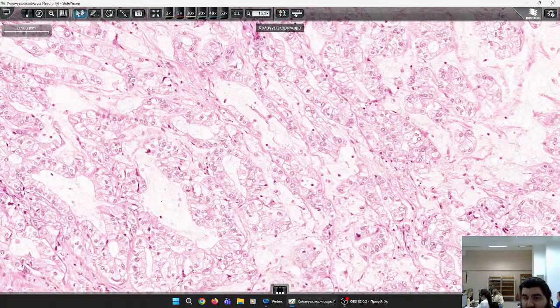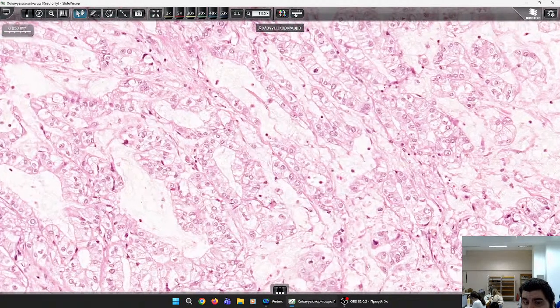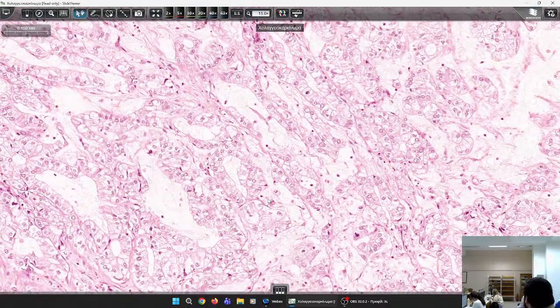There's no formation of trabeculae. There are glands back to back, fused together, irregular. They are not functional. You can't see bile. They're not connected to a normal liver parenchyma, so they can't harbor bile. They are empty here.